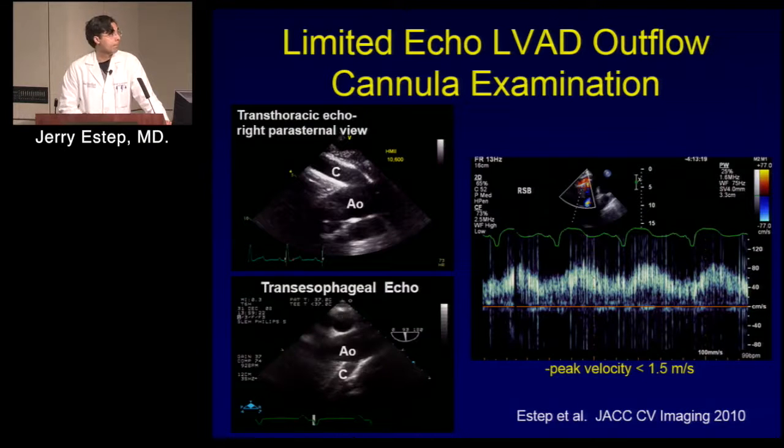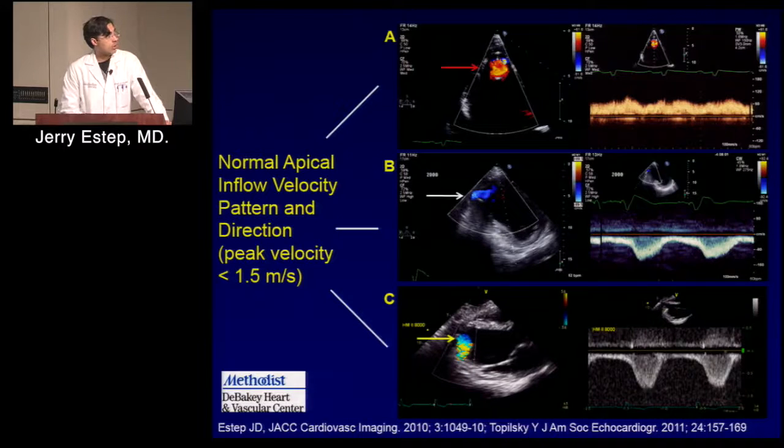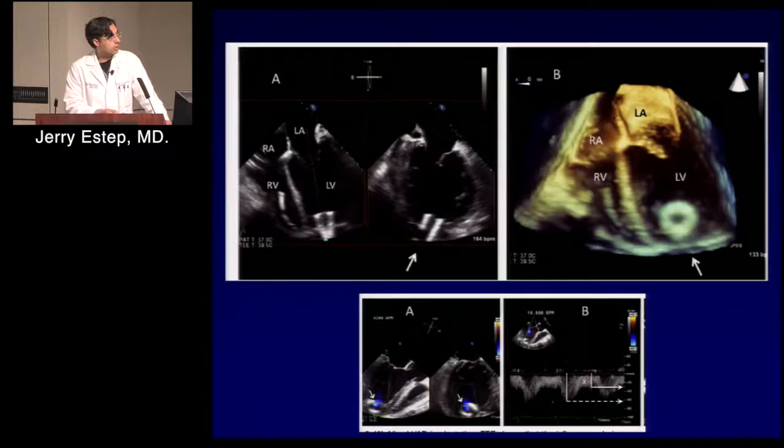Yeah. 1.5 is the systolic contribution. So that's the peak. So what we really want is both. We want the peak systolic velocity and the nadir velocity, the systolic and diastolic. Yeah, but we want all this to be underneath 1.5. Or if you look at a cohort of 100 patients on the HeartMate 2, and these different pumps have different ranges, to be honest with you, but you should not see obstructive flow. So yeah, thank you for that question.